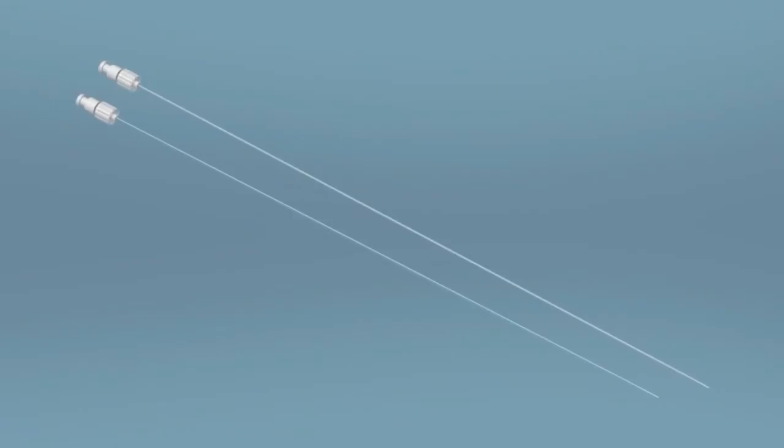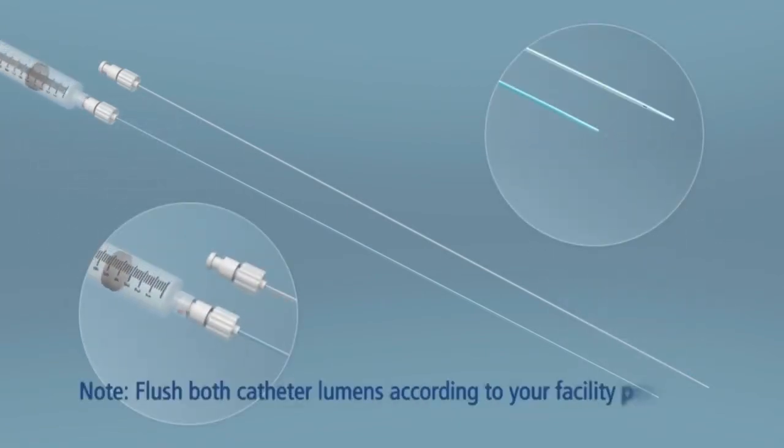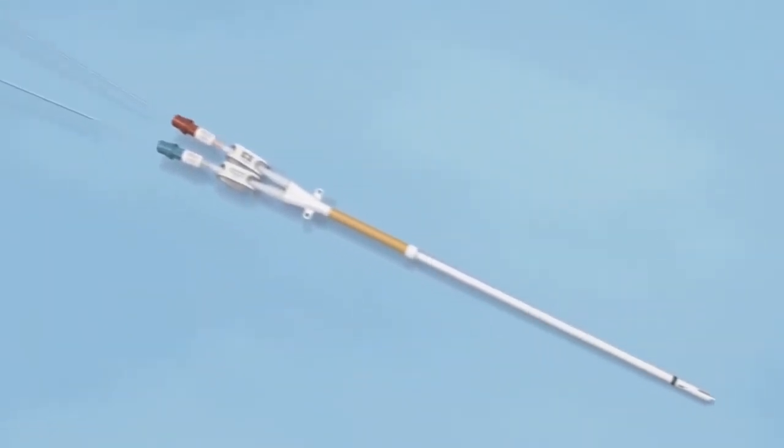The optional Tal-Vena-Trac over-the-wire insertion stylets were designed to facilitate over-the-wire or sheathless insertions. Flush the Tal-Vena-Trac over-the-wire insertion stylets with sterile saline prior to use. Wetting the outer surfaces of the stylets as well may facilitate advancement into the catheter. Load the stylets into the catheter.